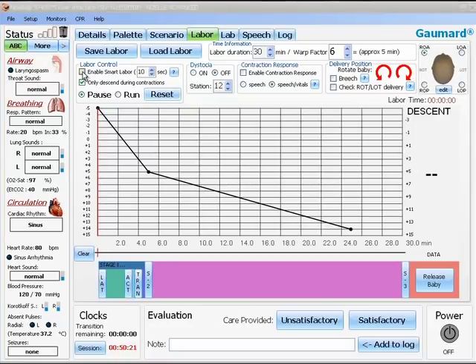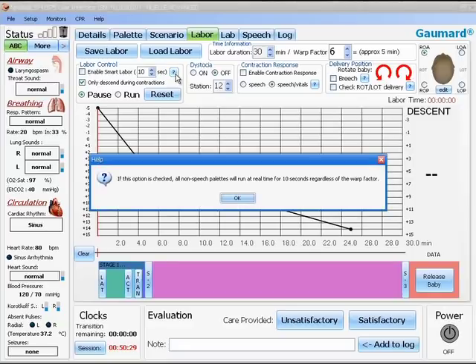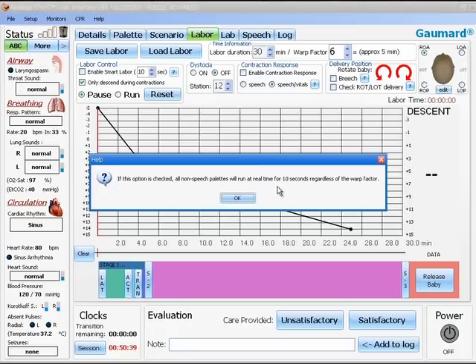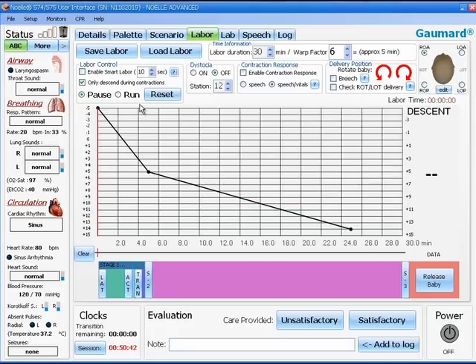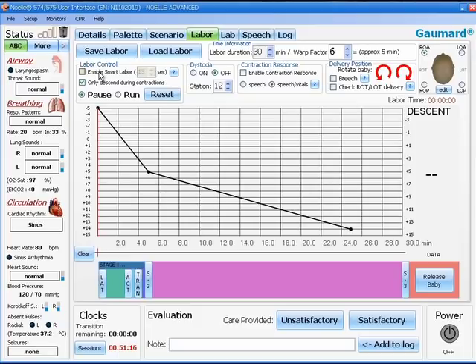The other two controls in this box are labeled enable smart labor. There is a time duration and there is a question mark. If you click on the question mark, it will tell you that all non-speech palettes will run in real time for 10 seconds no matter what you have the warp factor set on. It is possible to change this time window just by clicking the up down arrows to the right of the 10 seconds. The check box on the left turns the smart labor on or off.